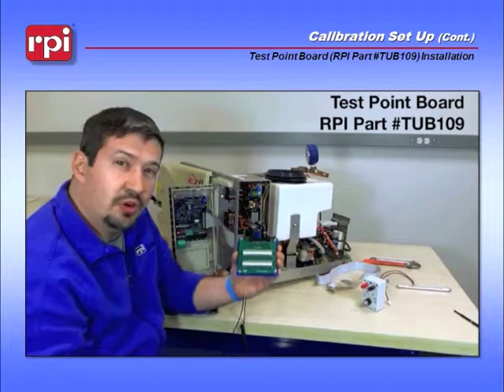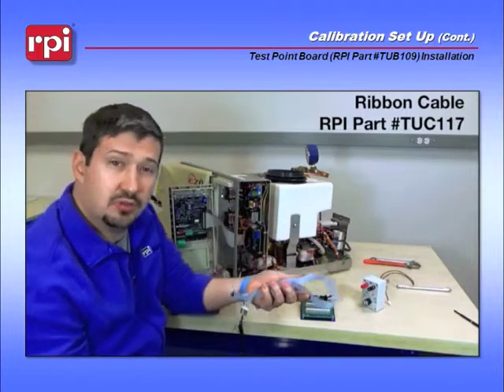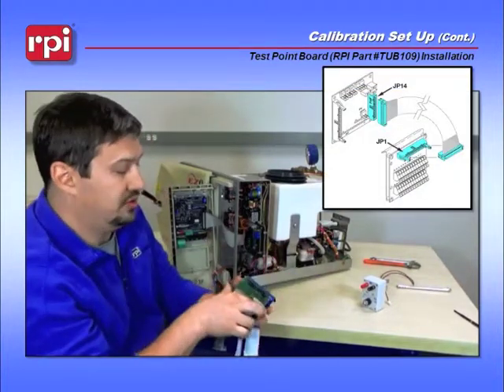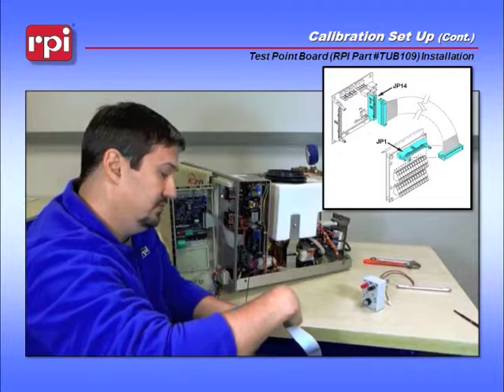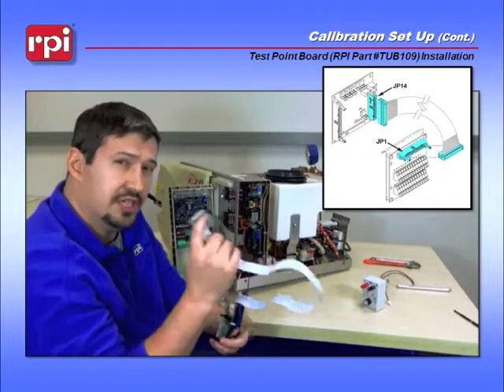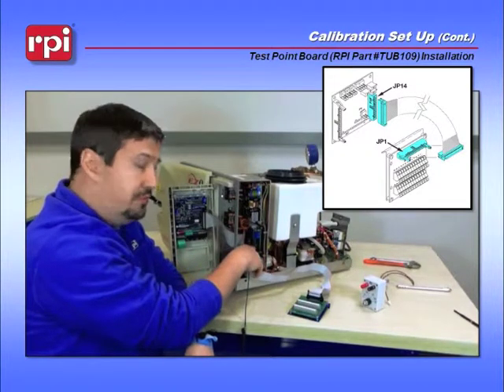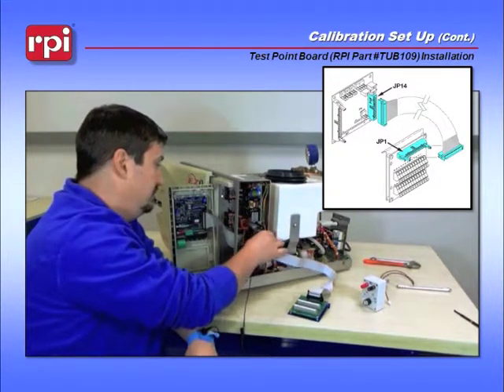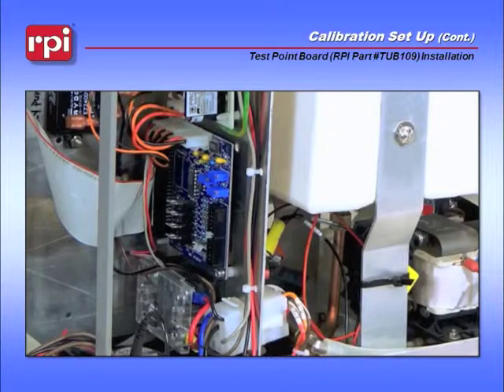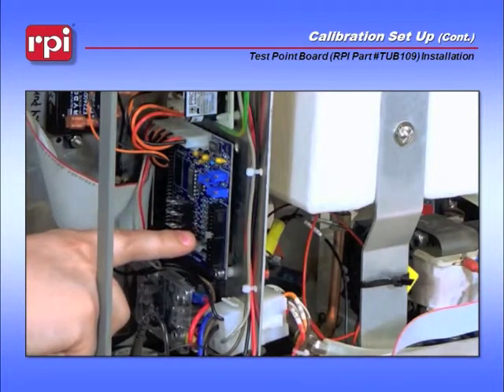Next, grab your TUB-109, which is your test point board, and the TUC-117, which is your ribbon cable. Connect the ribbon cable to JP-1 on your test point board. Push it down until it clicks both tabs in. Then take the other end and connect it to JP-14 on the Adjunct-3 board.